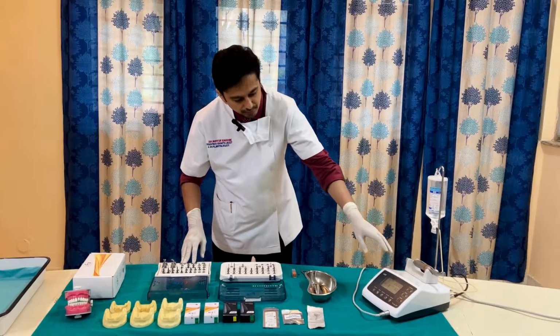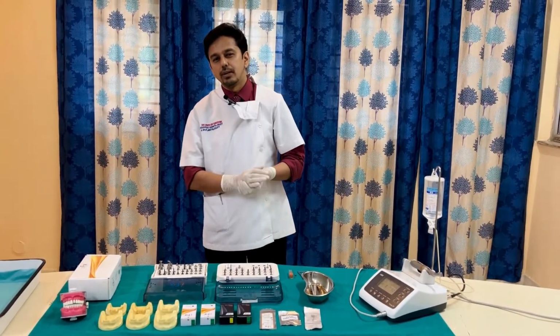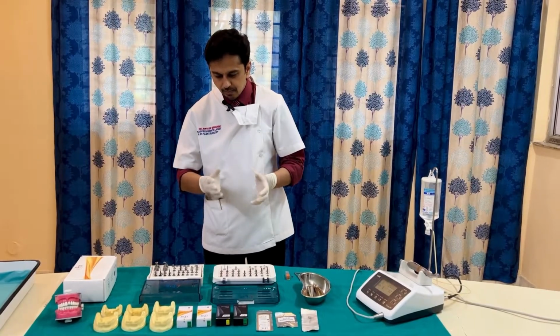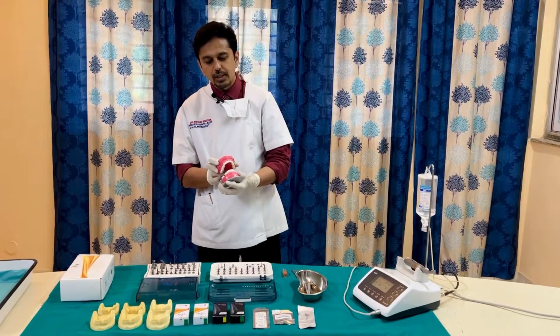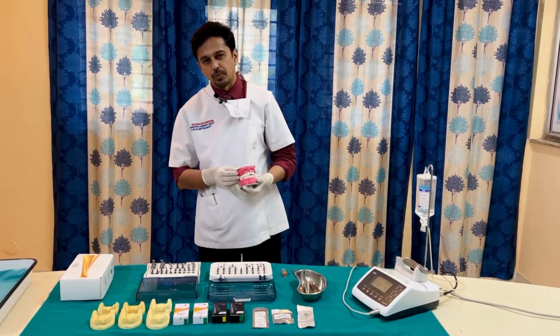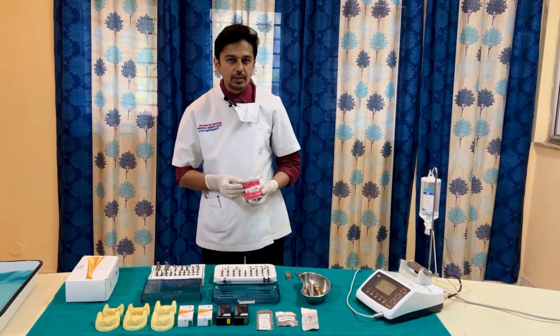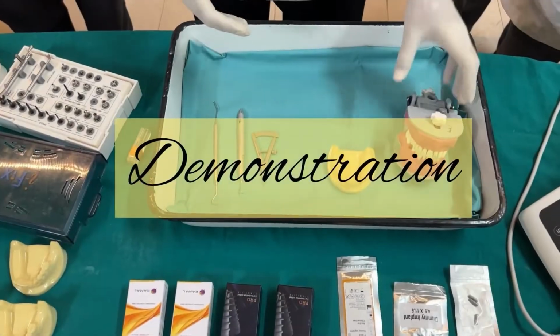We'll be demonstrating the various parameters of Physiodispenser that we are supposed to keep in mind while drilling. And then finally, some basic tips and tricks of how the angulation of the implant is supposed to be managed whenever we are doing the osteotomy preparation. So without any further delay, let us start with the demonstration.